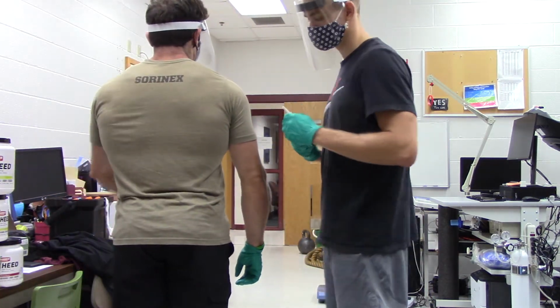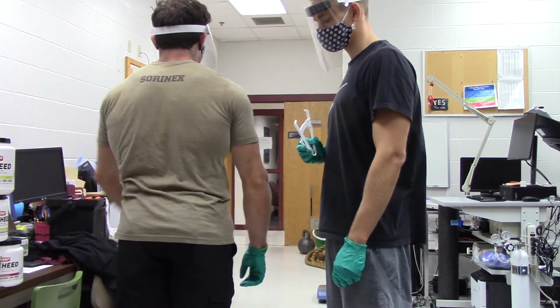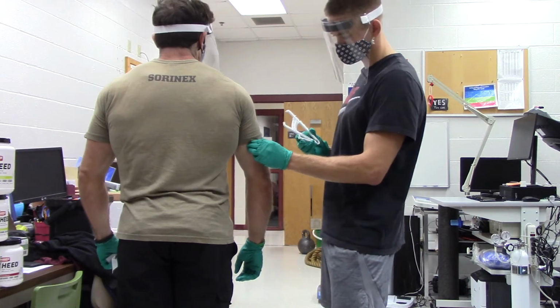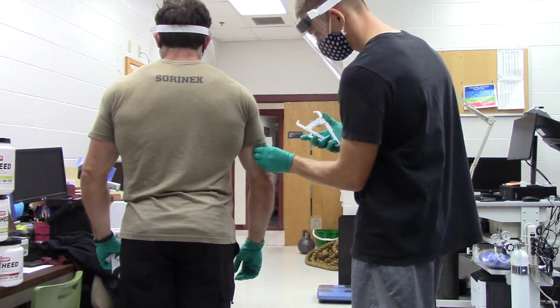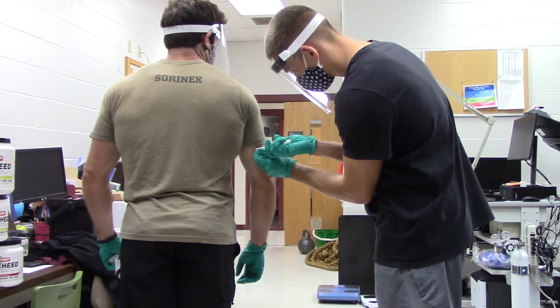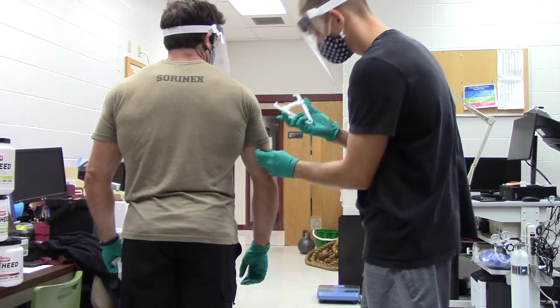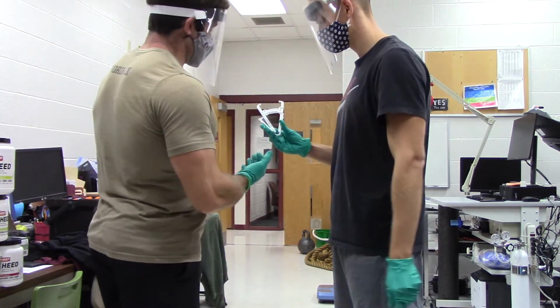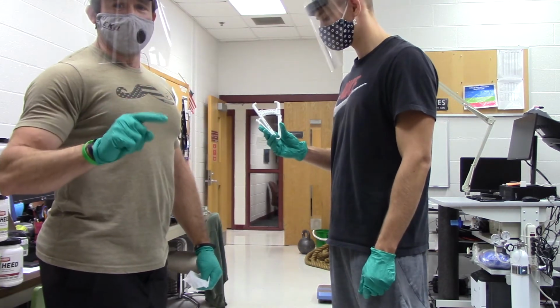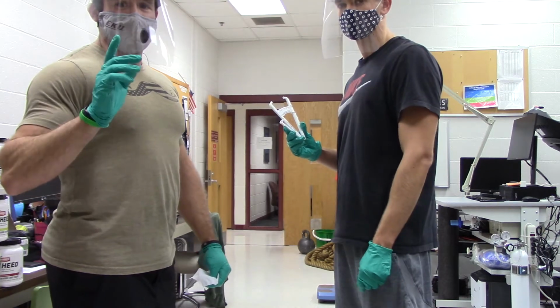The tricep measurement is going to be half the distance between your AC joint and your olecranon process. So he's going to grab, in that halfway point, both the skin and the fat up, and then he's going to go ahead and measure, closing the caliper with the one hand until he gets a good measurement to click in. Then he's going to open the caliper, and then he's going to release the skin fold, and then he's got his measurement. And he came up with a number of 5. Now he's going to do the measurement again after we go through all the other sites. We're not there yet, so let's keep going.